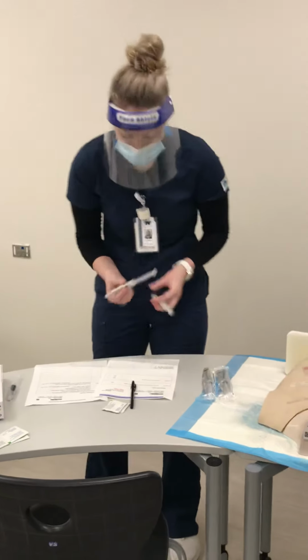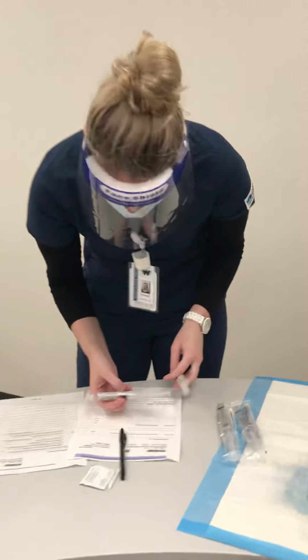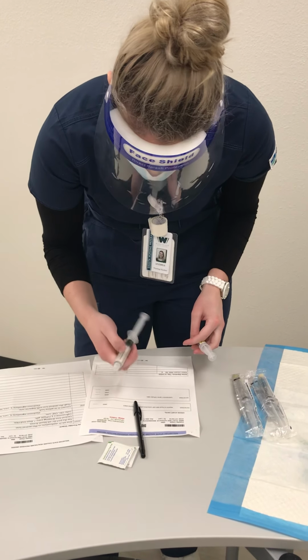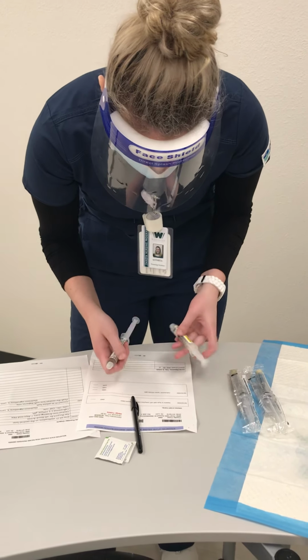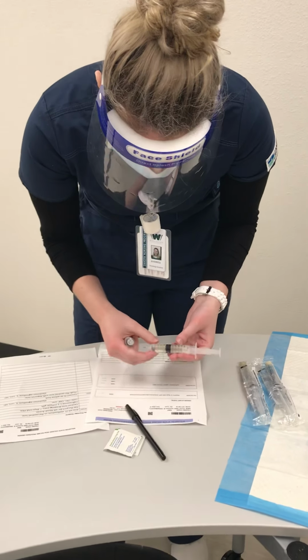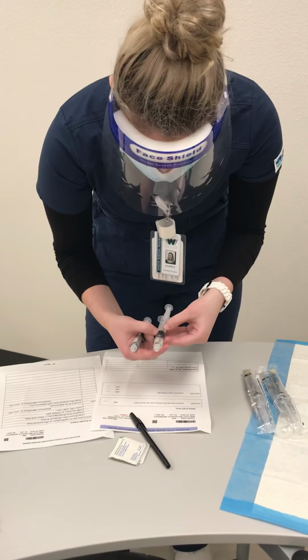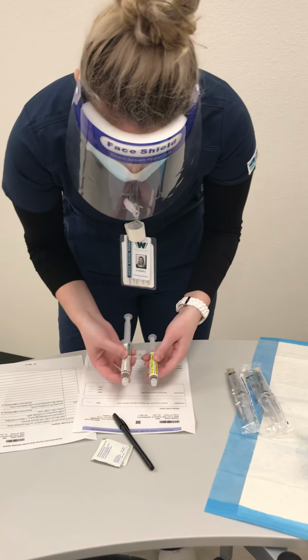So my first med check, I see I have ceftriaxone 1 gram, and it's a pre-filled vial, and it's set at 10 milliliters, so I know that that is correct. And then I also have my heparin flush, 500 units per 5 milliliters. And this is 5 milliliters, so I know this is correct as well.